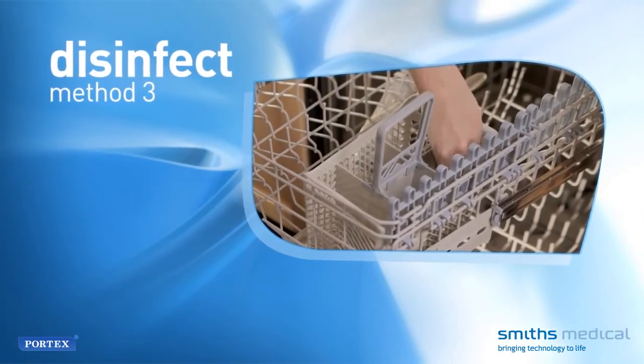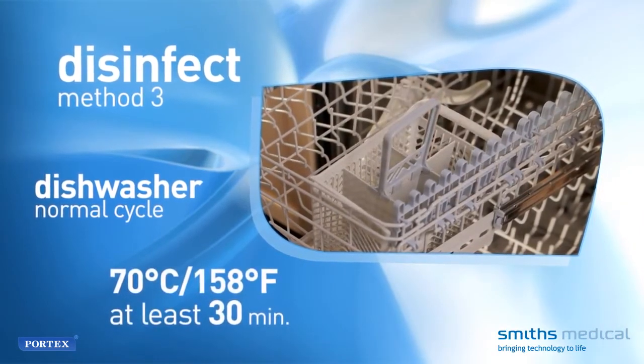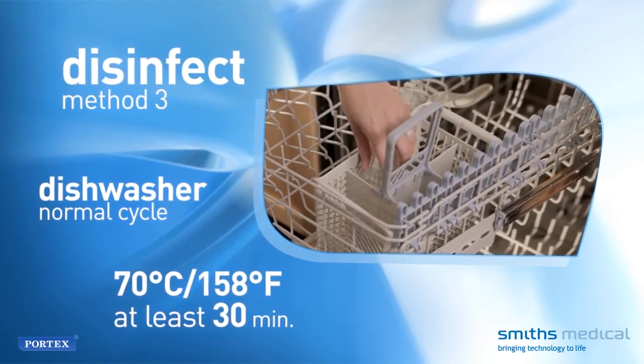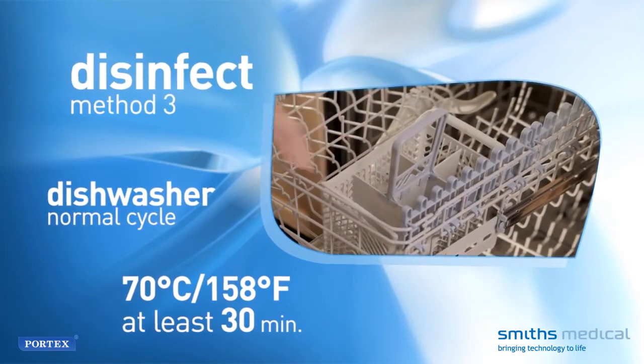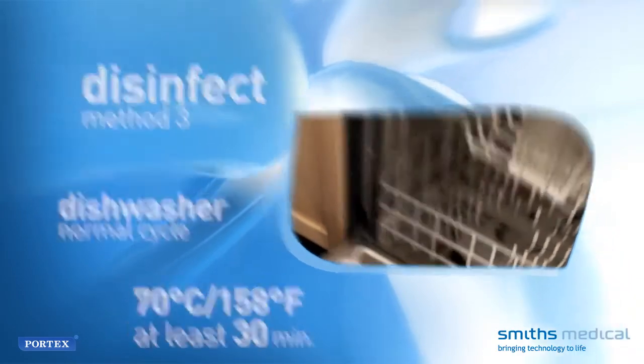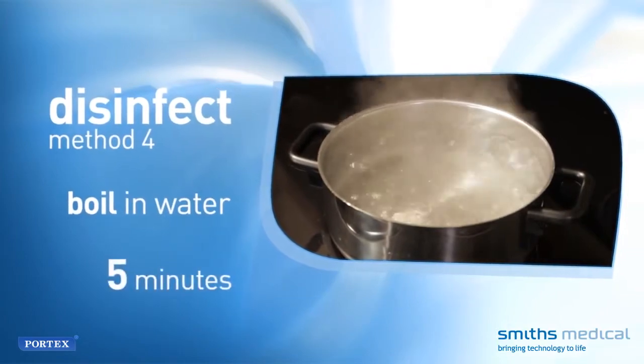Method 3: Place the unit in the top shelf of a dishwasher for a normal cycle, with water temperature greater than 70 degrees Celsius or 158 degrees Fahrenheit for at least 30 minutes. Method 4: Boil the unit in water for 5 minutes.